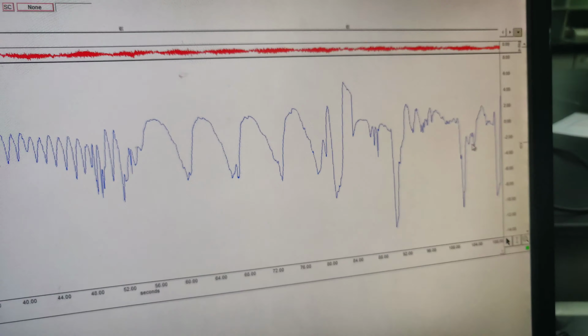Okay. So this is the first segment for your first activity, which is the normal breathing. From here, you can refer to your manual. Your manual requires the three best cycles from your first activity. So you can choose 3 best cycles, and from these you can highlight a few things such as the delta T and also the BPM.